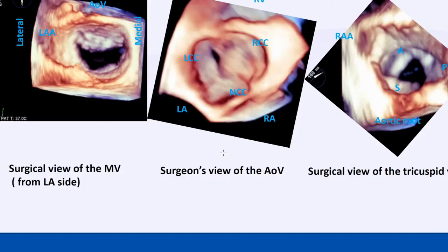This is a surgical view of all the valves. We have the mitral valve surgical view for a long time, but for other valves we have to develop it. In surgical view of the mitral valve, the left atrial appendage is always on your left side, with the surgeon standing here. For the aortic valve surgical view, we can identify the non-coronary cusp, left coronary cusp, and right coronary cusp, with the surgeon always standing beside the non-coronary cusp.